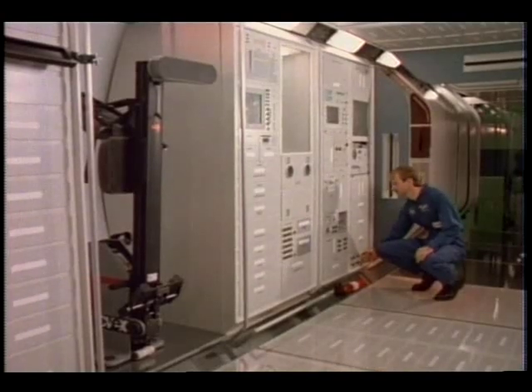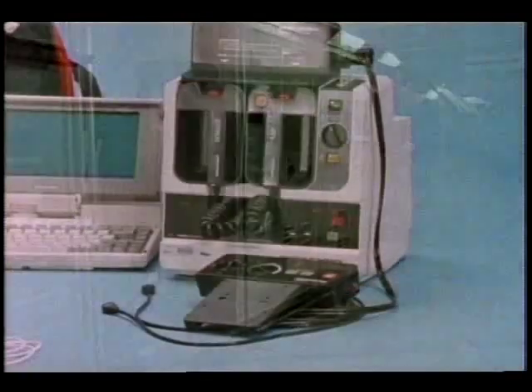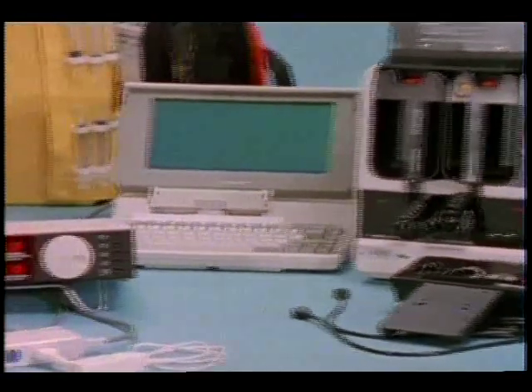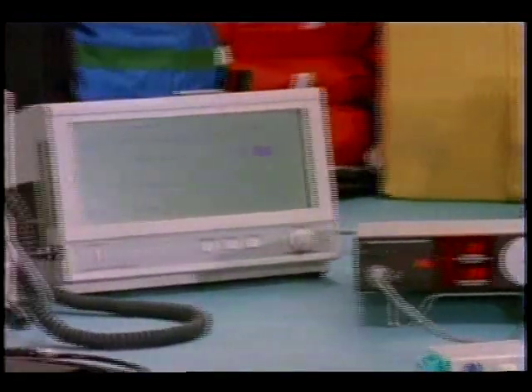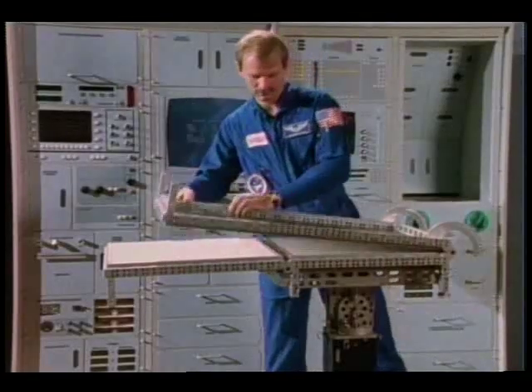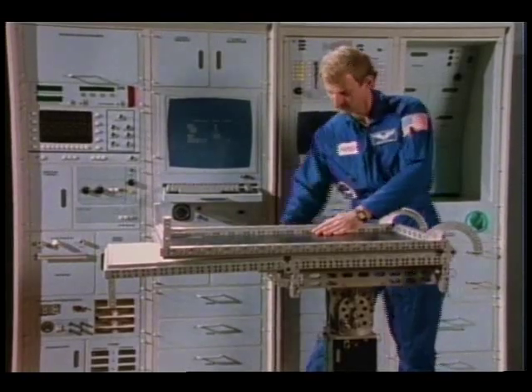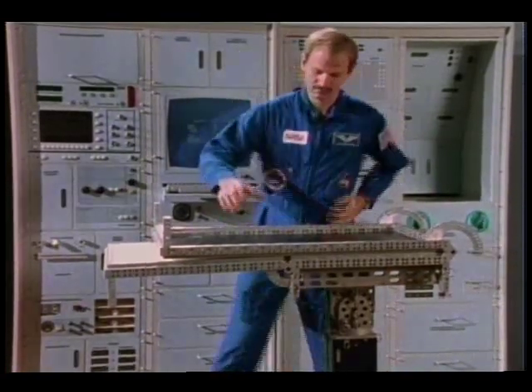In order to provide maximum flexibility, the HMF will have a modular design. Each piece of equipment will be self-contained and will be held in standard space station equipment racks. This modular design will allow the components to be switched out easily for repairs or to be upgraded as new technology becomes available. The patient restraint system, which provides the treatment area, will be located in front of the racks and will be stowed when not in use.